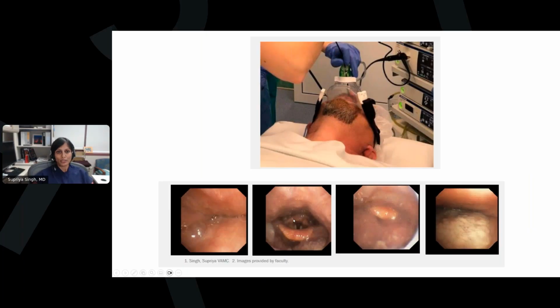This is how we do the last part of the study, where we utilize the CPAP with the special mask. So we utilize the pressure that the patient had been prescribed in the past. And in this scenario, you can see that as we go in, posterior pharyngeal wall, this is the soft palate, it's completely collapsed. This is called an anterior posterior complete collapse. We had to do a jaw lift. As a result, the oropharyngeal area did open up significantly. And once we let go and just had the CPAP running, basically there was no opening at all. As a result, the patient was desaturating, and this is because of the apnea happening in real time.